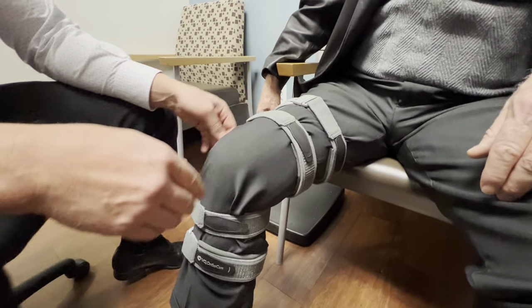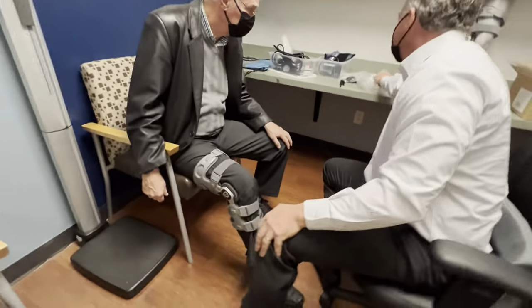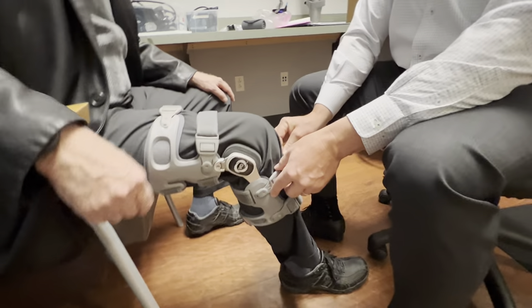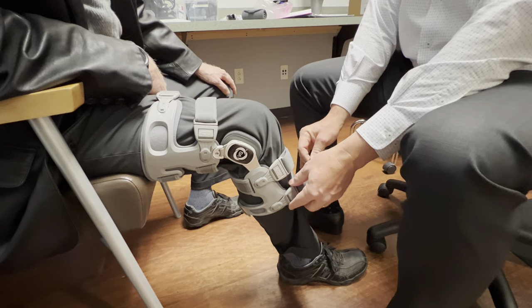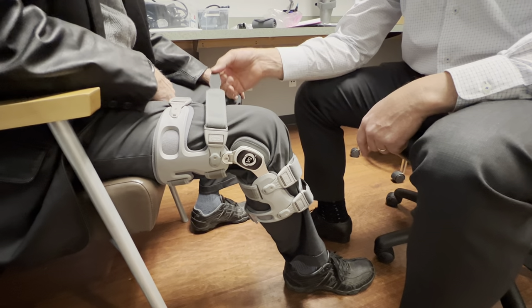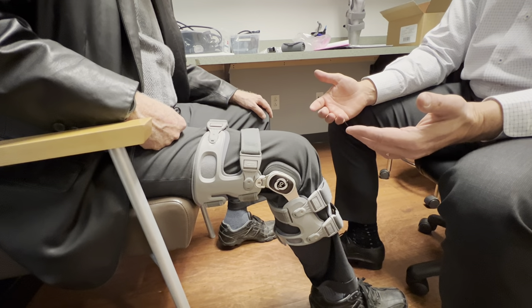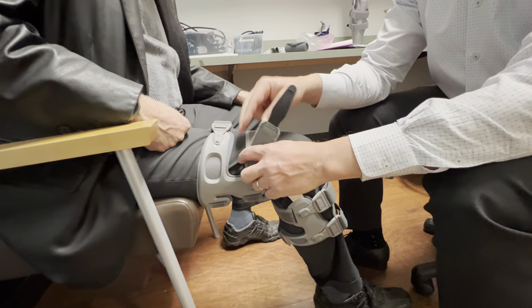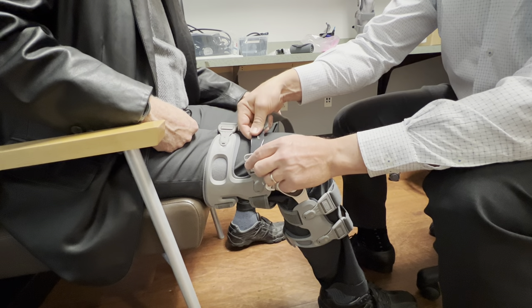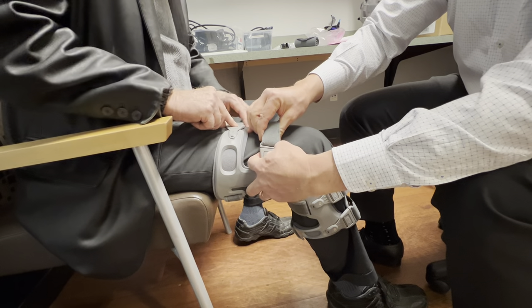Now we've got the straps all set. We're going to teach them how to use it. Let's talk about taking the brace off since we're here. When you take the brace off, gently loosen the strap just a little bit to make it easier to reconnect once you put the brace on again. You never want to fully un-velcro these straps — there's no need to. All you have to do is push and pull.